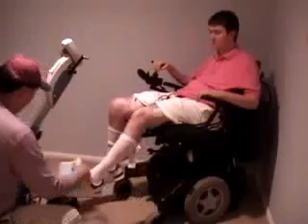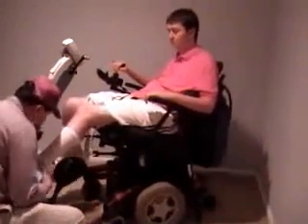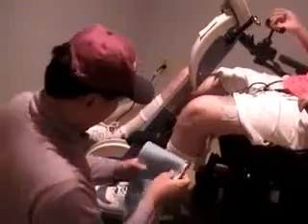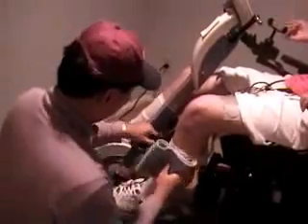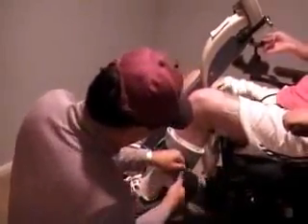This is the RT300, one of my favorite pieces of equipment in my home gym. Right now you're seeing myself, Josh Basil, and my caregiver, Neil Minello, setting up on the RT300.